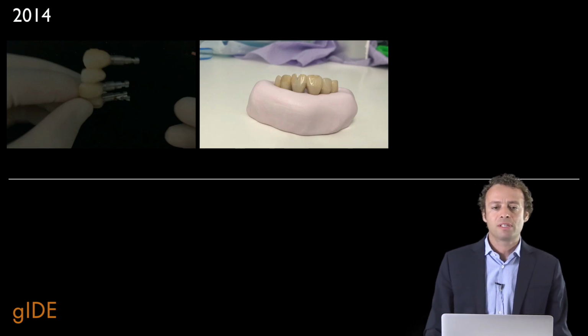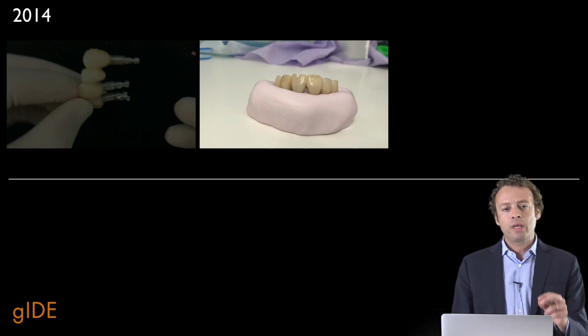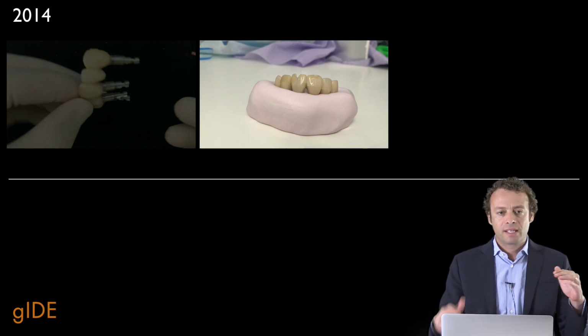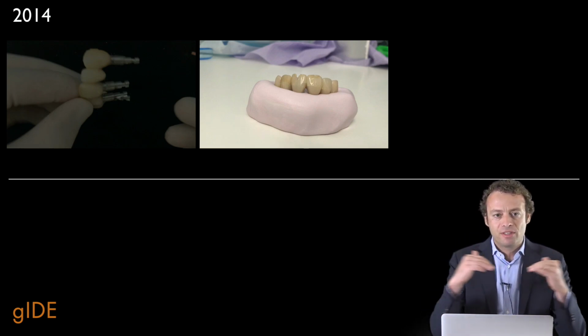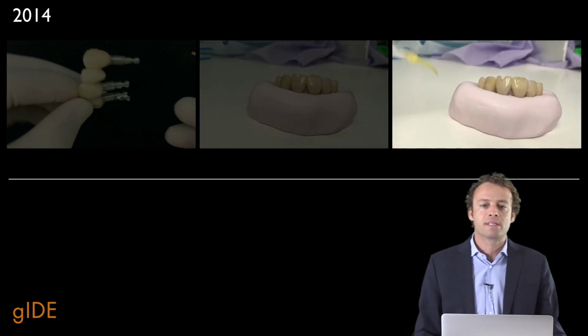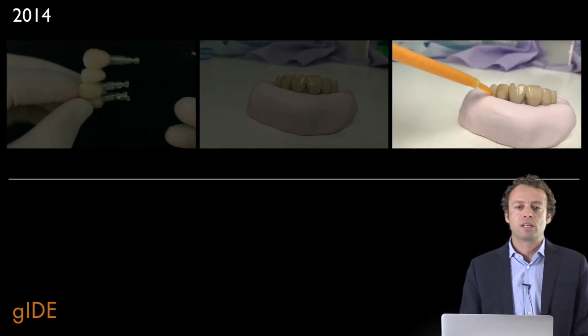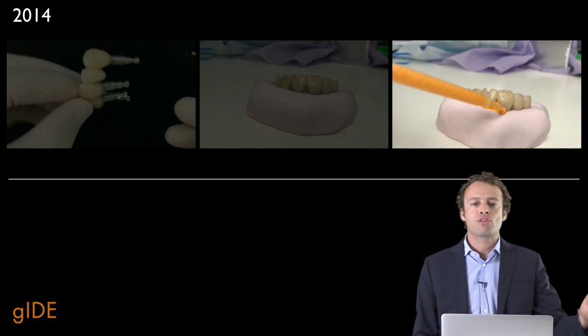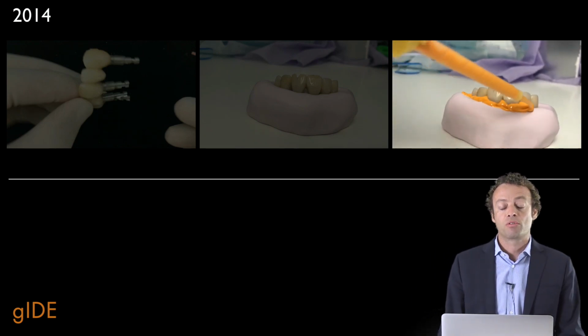And then we copy exactly the most critical area, that is the area that we have in the cervical portion of the restorations. We copy this area using a really ultralight silicone material, the same one that we use for taking the impression on natural teeth or also on implants.